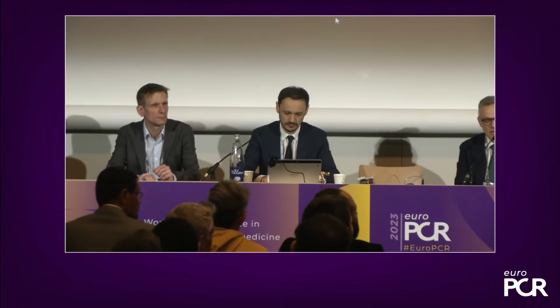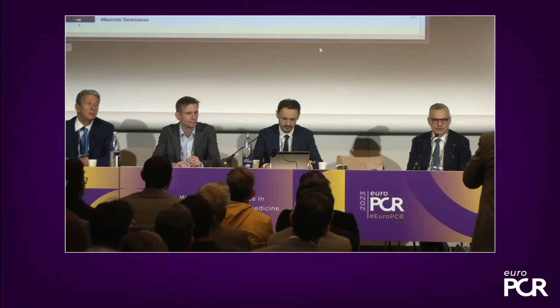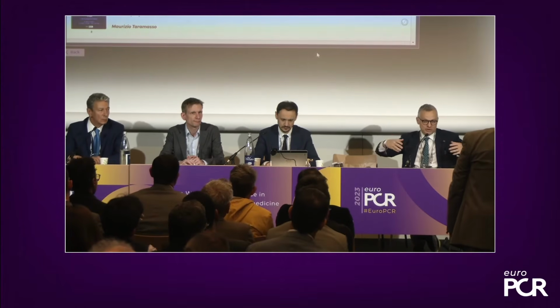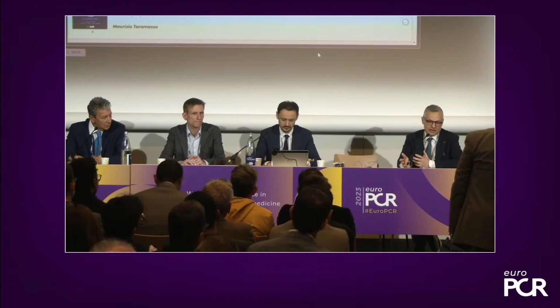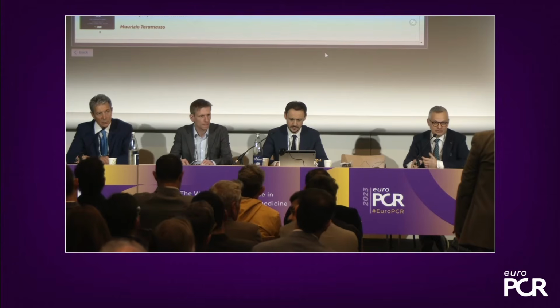So, questions from you guys? Yeah. Come, please. Hello, Samir Wafa from Egypt. Sometimes if the patient is obese, you have to go perpendicular, to be close to the artery, to avoid missing the puncture. So what do you do in this case? You cannot go 45 degrees. It's a good point. The thicker the patient, the more vertical you need to go. So I agree with you. Sometimes we need to compromise. Yes, you can do that.